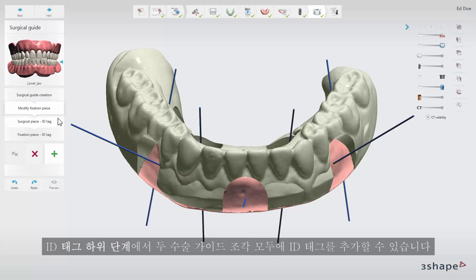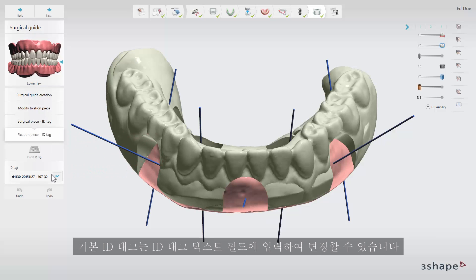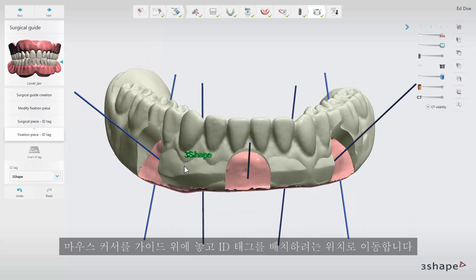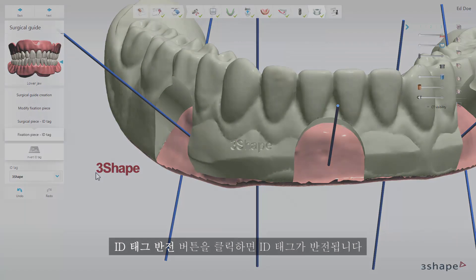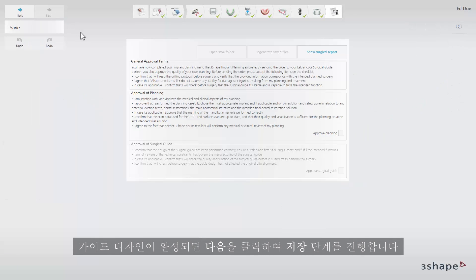On the ID tag sub-step you can add ID tags to both surgical guide pieces. You can change the default ID tag by typing in the ID tag text field. Move the mouse cursor over the guide and move the ID tag to where you wish to place it. Left click the guide to place the ID tag. Click the invert ID tag button to invert it. When the guide design is finalized click next to proceed to the save step.